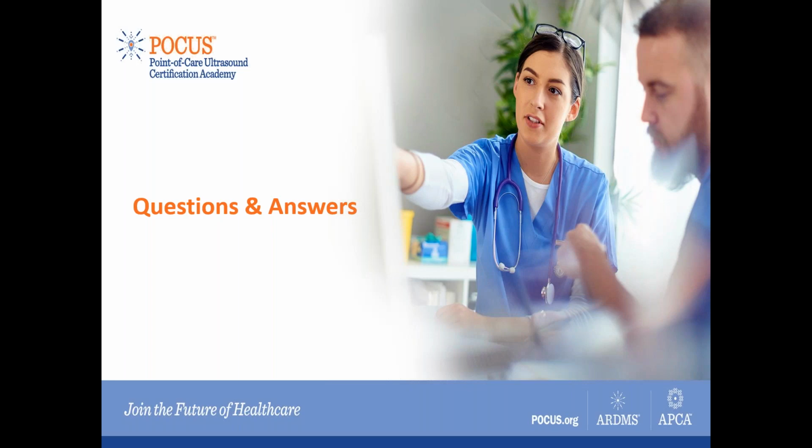The next question that has come in is, what are the ultrasound features of chronic DVT and acute on chronic DVT? Well, there are no exact rules about that, but generally what you notice is the acute DVT is going to be anechoic, could be hypoechoic also, so it's a little grayish in color. It will be homogeneous, it's got more uniformity in it, and then obviously the vessel that's involved will be dilated. The diameter will be much more as compared to the opposite side, and it's more compressible. It's more like a jelly, like clotted blood. And so that's what we expect.